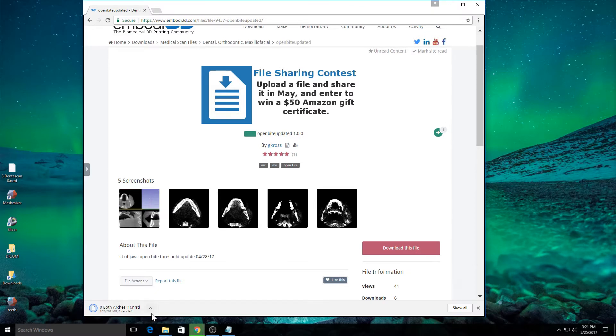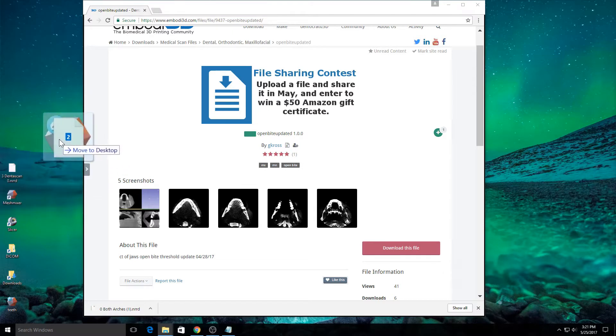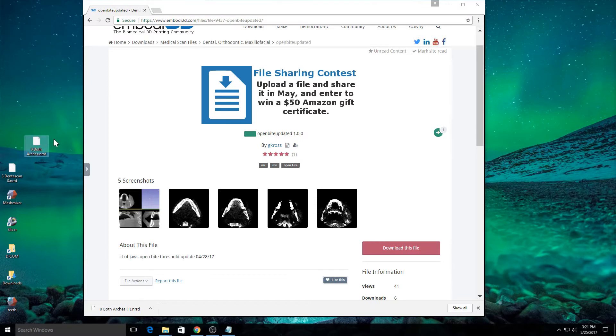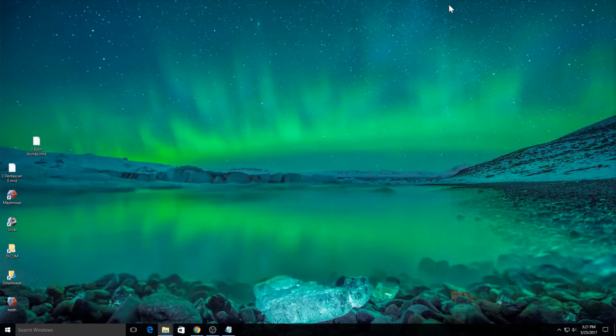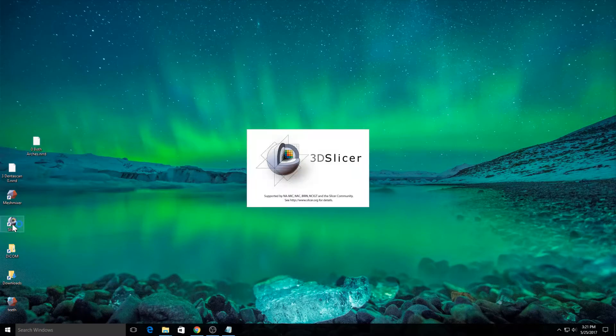We've downloaded the file here. And here it is right now. It's called both arches.nrrd. Now let's go ahead and inspect this file. It's an NRRD file, which is a kind of anonymized medical file format.